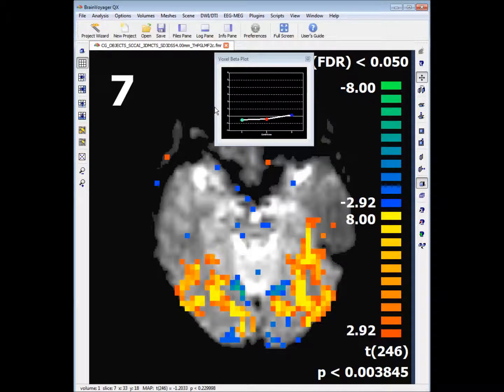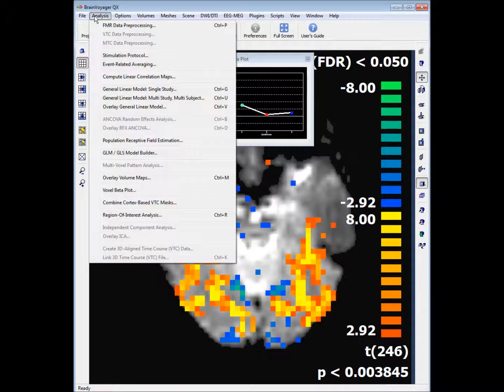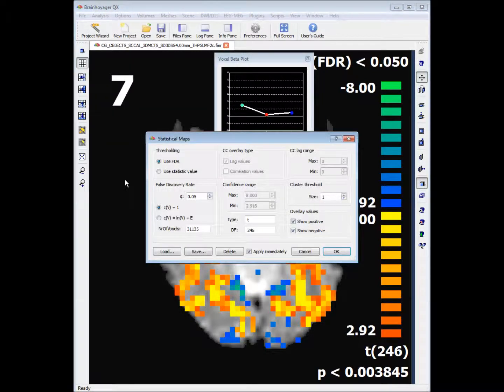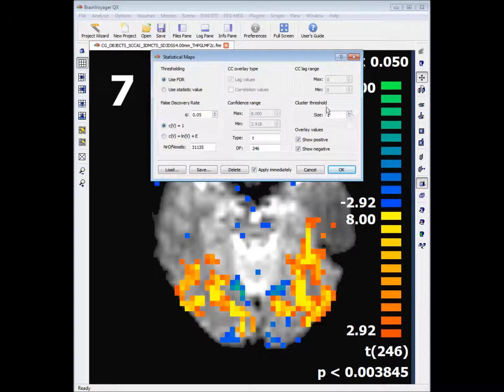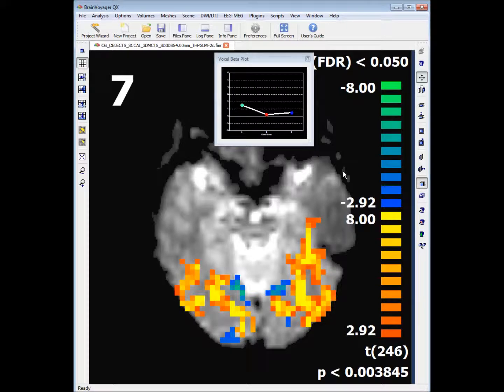We can describe this as being a bit messy. So what we can do to fix this is go into Analysis and click on Overlay Volume Maps. We can increase the cluster threshold to about 6, and what this will do is get rid of points that are just approaching significance.